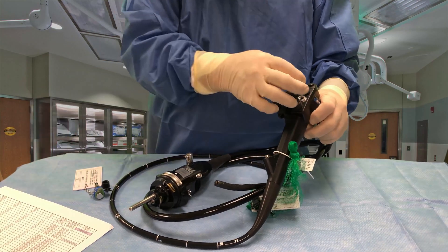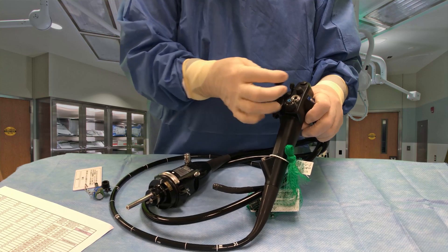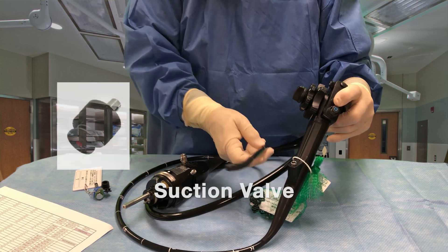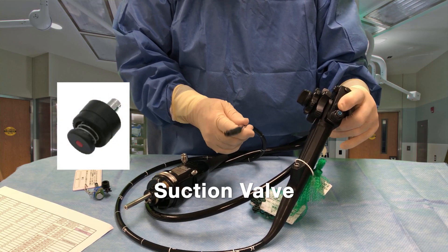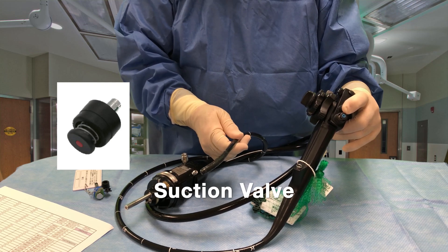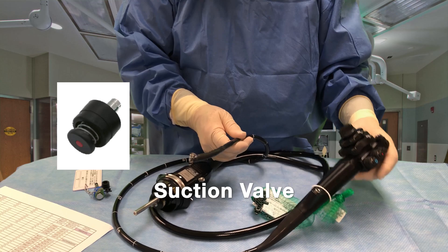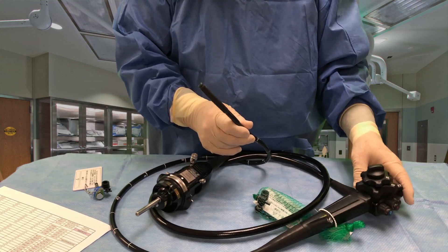The other valve up on top here — notice it has a red dot on the end. That's suction. When you push that button in, that allows the 2.8 millimeter working channel to suction up fluids wherever you may be in the body if they're in the way. You can also suction out the CO2 as well. It works very well.